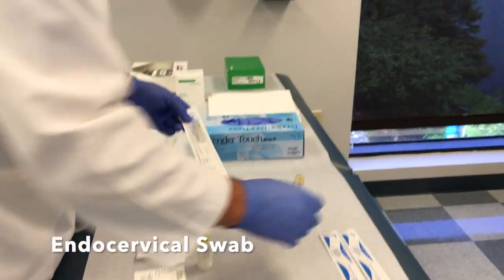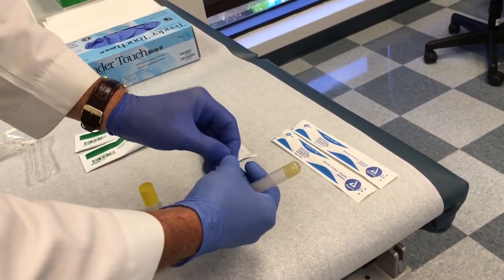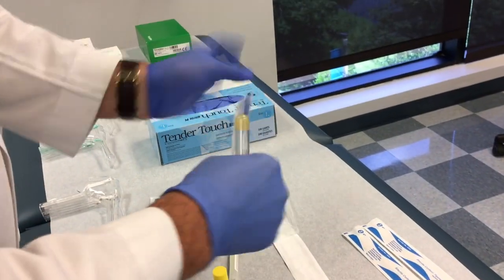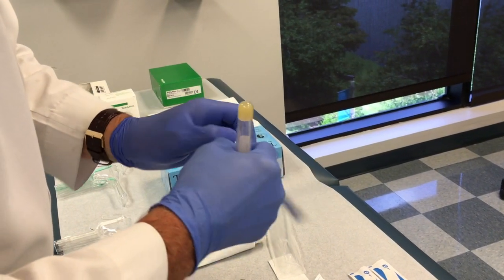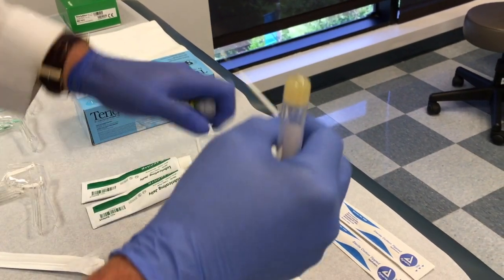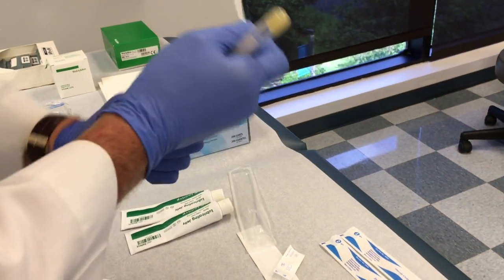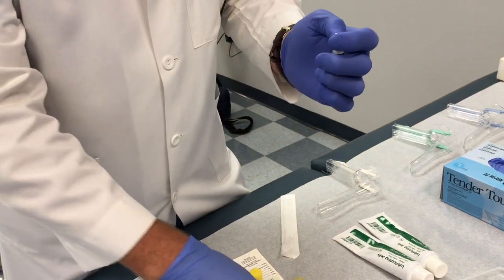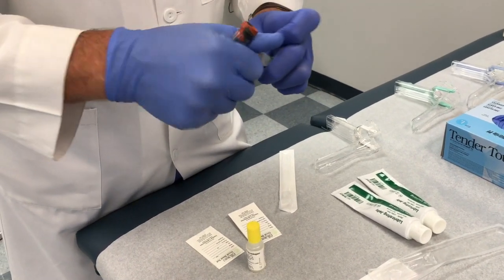This is a swab we're going to use for our patient, and it's used to test for STIs. This swab comes with its own little white swab. This will be an endocervical swab — it goes within the cervix. When you put it into the cervix, it's just a turn with your hand, and then it will go inside the container. This is one test for GC and chlamydia.